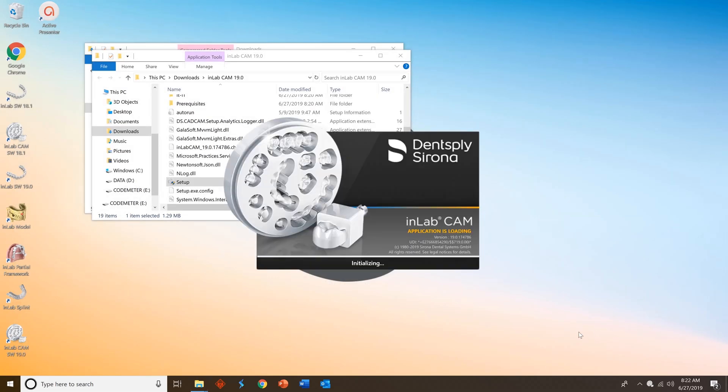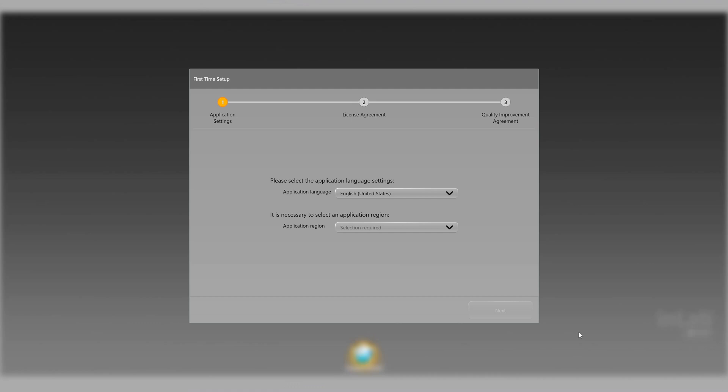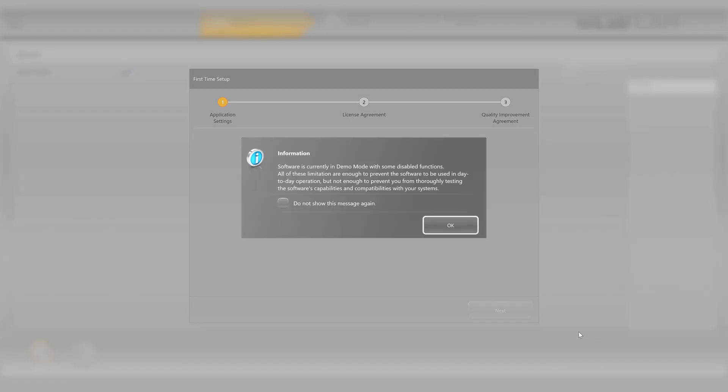If you receive a pop-up about being in demo mode, go ahead and press ok. We'll take care of that when we add the license key later on in this video.